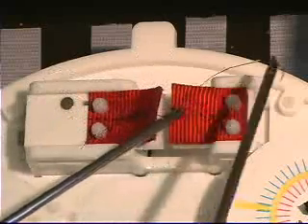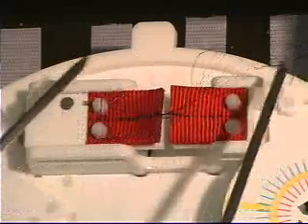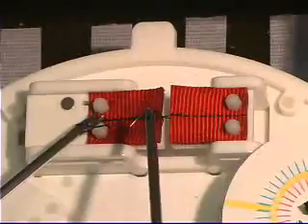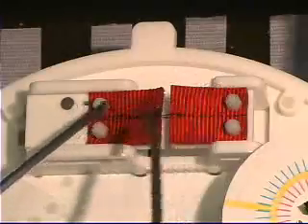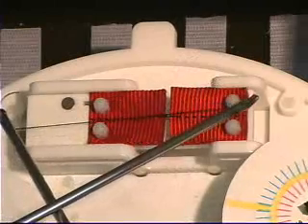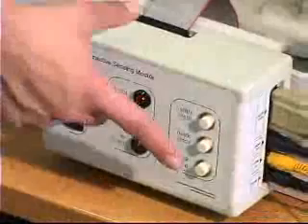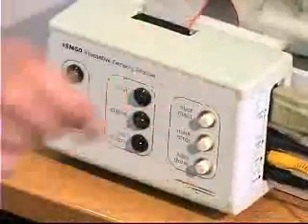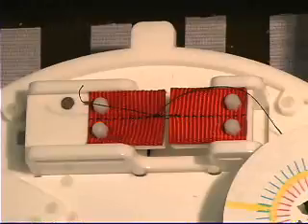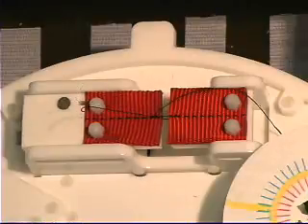Two half hitches of a square knot in opposite directions are formed in order to lock the stitch. In order to activate the tensometer, either the examinee or the examiner must activate the Task Done button. Once this is done, the tensometer will be activated and will exert a disruptive force of approximately 2.5 pounds or 1 kilogram on the knot.